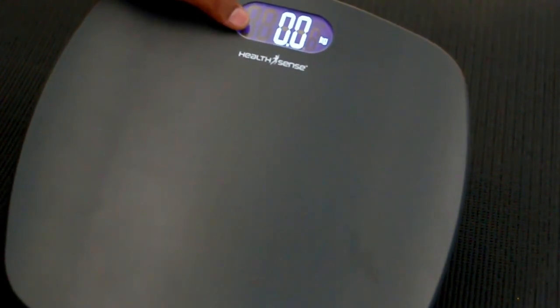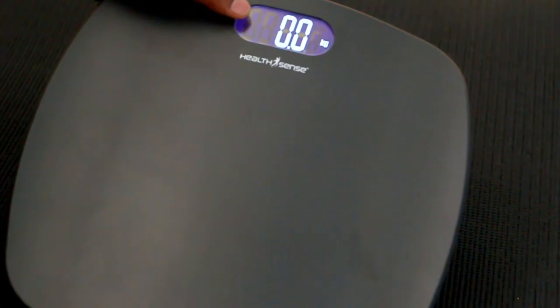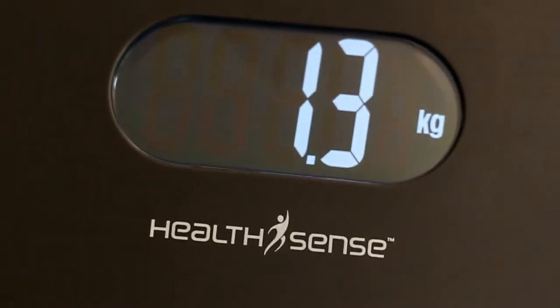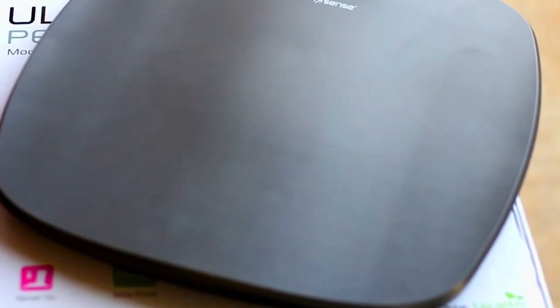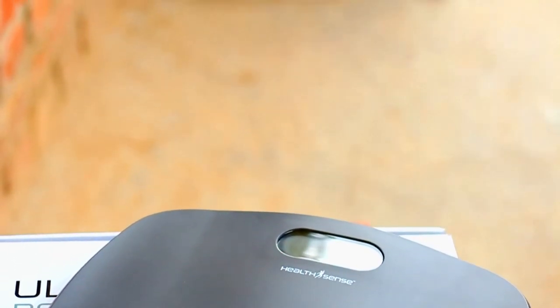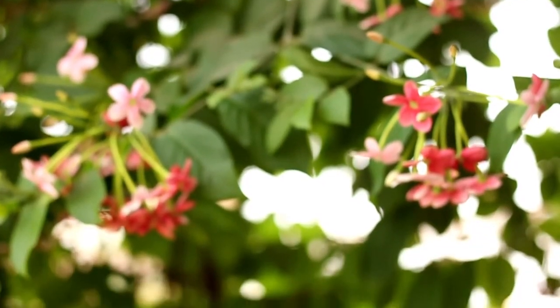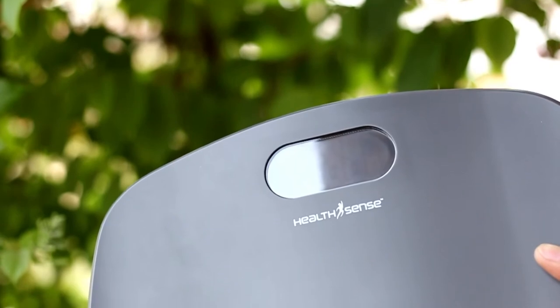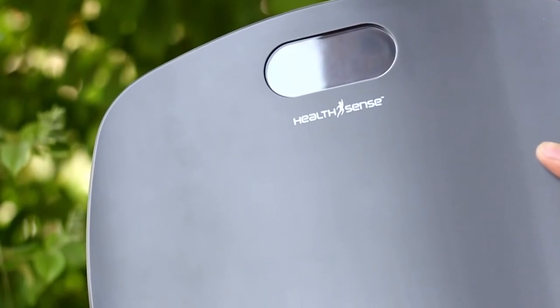So in the end I would definitely recommend this product because it's really worth the money. And if you're someone who is into fitness then you should definitely own this thing without a doubt.